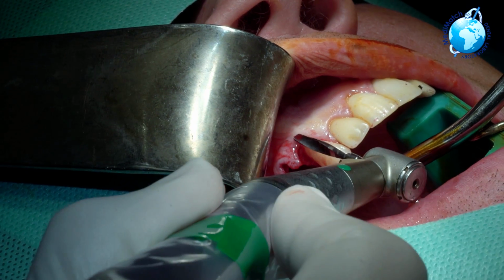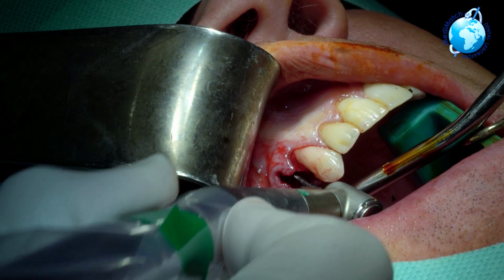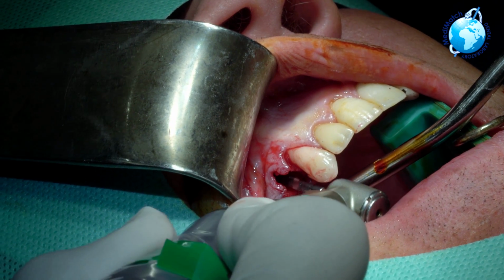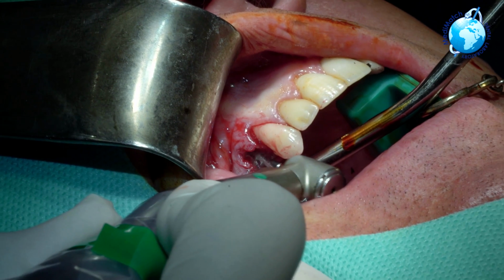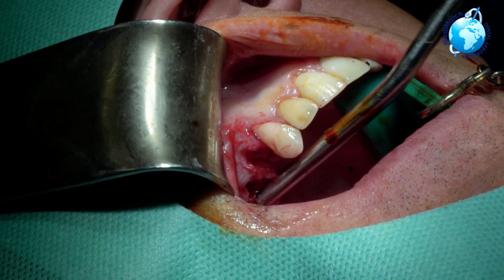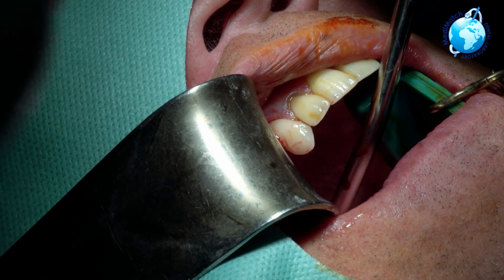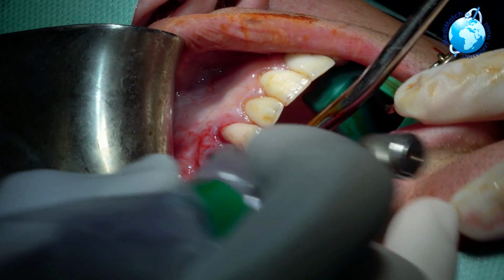Now, that's the root of your 3. The root of this is slightly mesially inclined from the CT scan. You can see my drill's going to the apex. What we want to do is go slightly behind that, and then start our drill, just to feel through that bone, just a couple of mil. Alan, how you doing? Good man. Okay, I'm going to use something called a drill extender, just to extend the drilling surface here, just to get a little bit more leeway, a bit of sinkage.